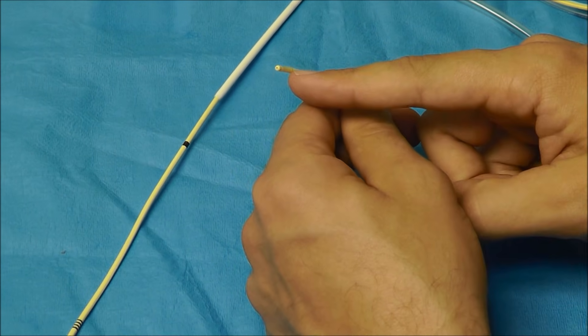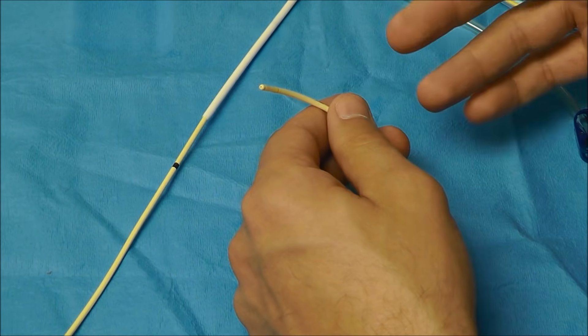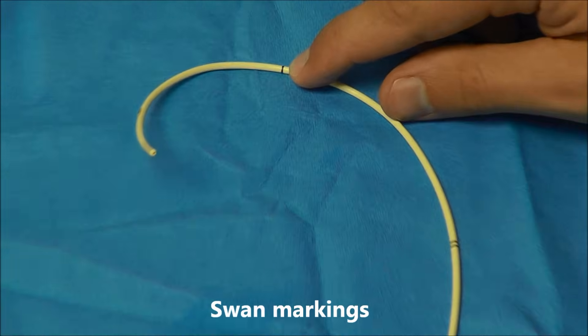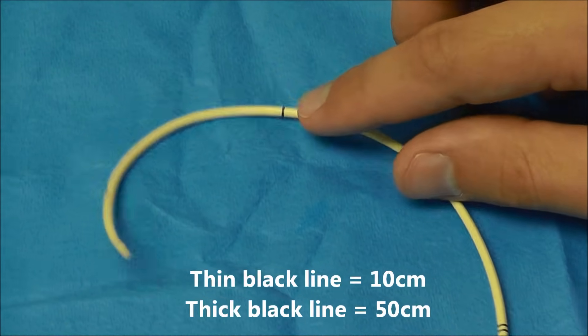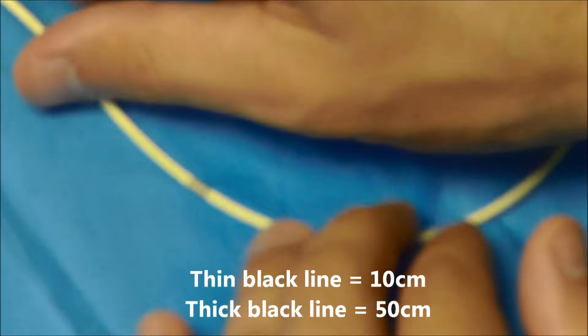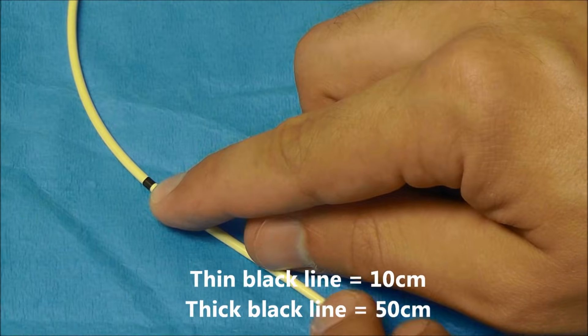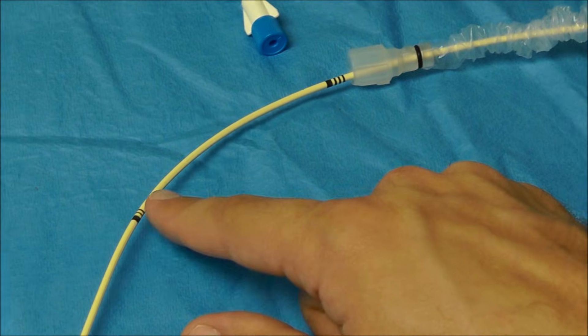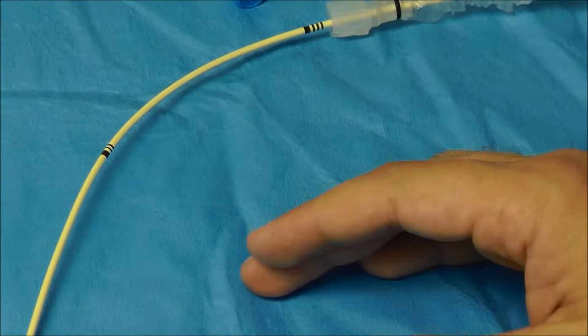And so you're going to need to deflate the balloon and pull back and try again. One thin black line there means 10 centimeters. So there's 10 centimeters, 20, 30, 40, and then a thick black line there means 50 centimeters. And it goes all the way actually up to 100 centimeters.